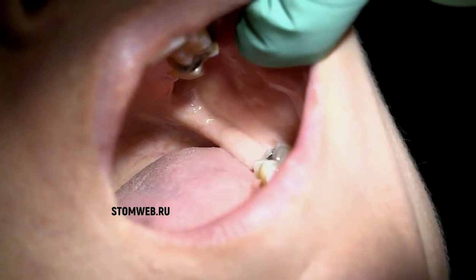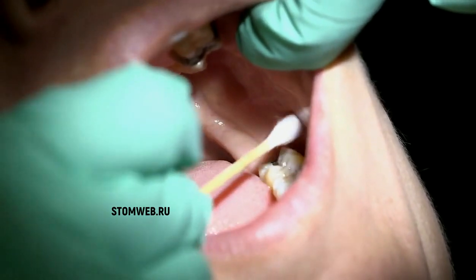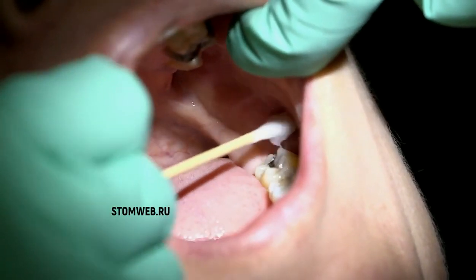Before we administer the local anaesthetic, we need to apply the topical anaesthetic. So first we will dry the tissues, and then we will apply the topical for 1 to 2 minutes.